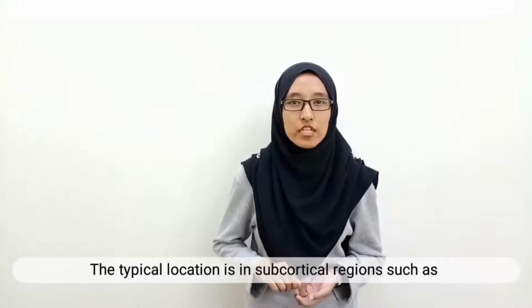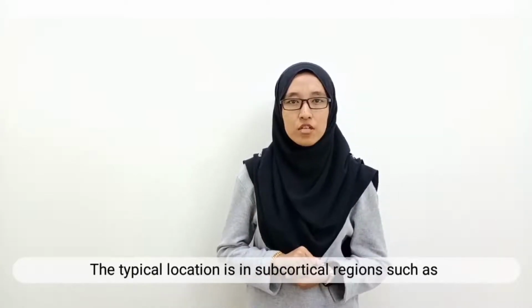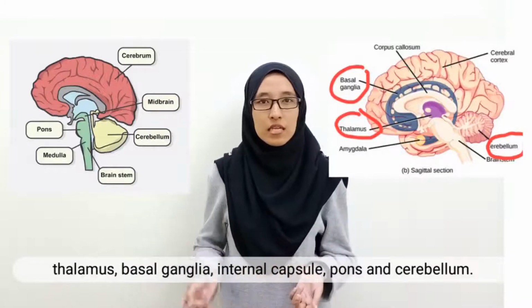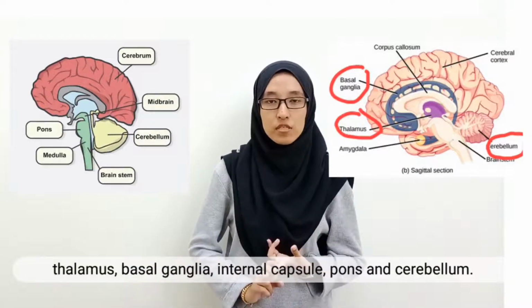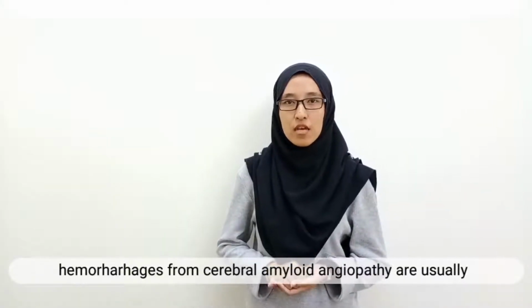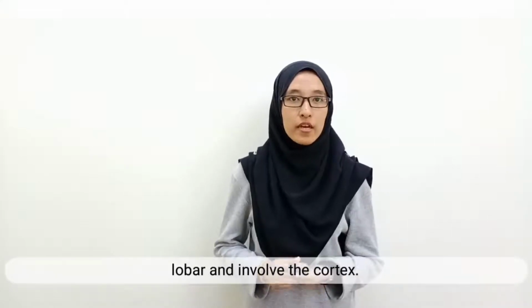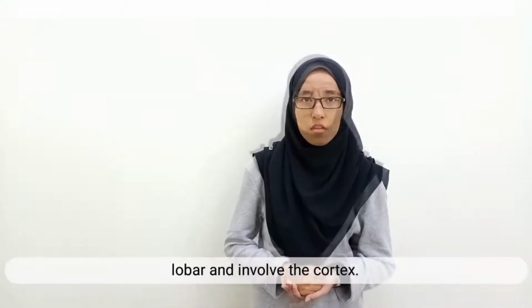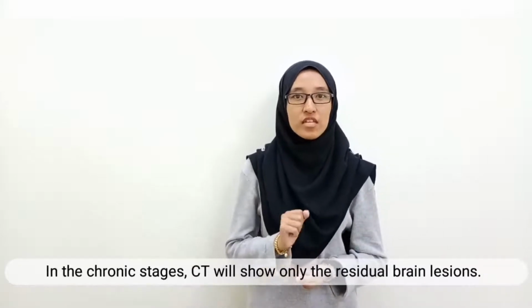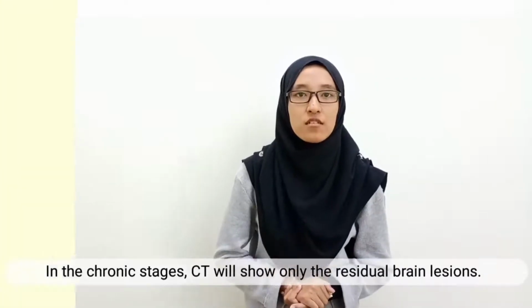The typical location is in subcortical regions, such as thalamus, basal ganglia, internal capsule, pons, and cerebellum. Hemorrhages from cerebral amyloid angiopathy are usually lobar and involve the cortex. In the chronic stages, CT will show only the residual brain lesions.